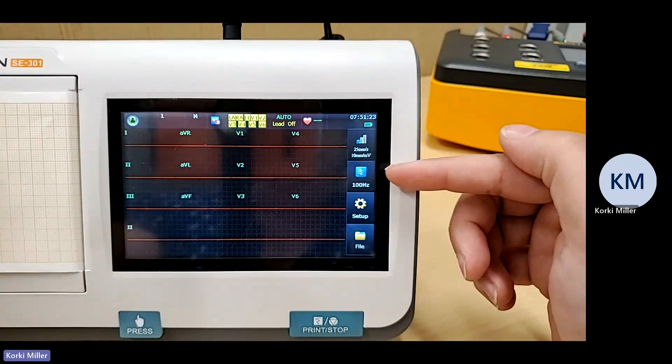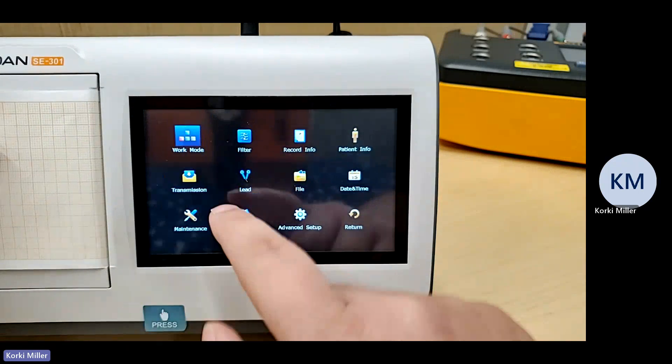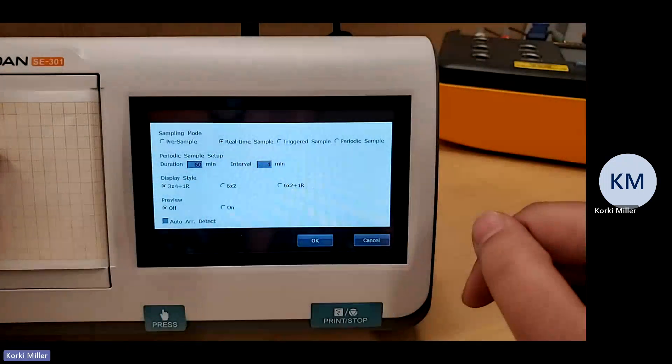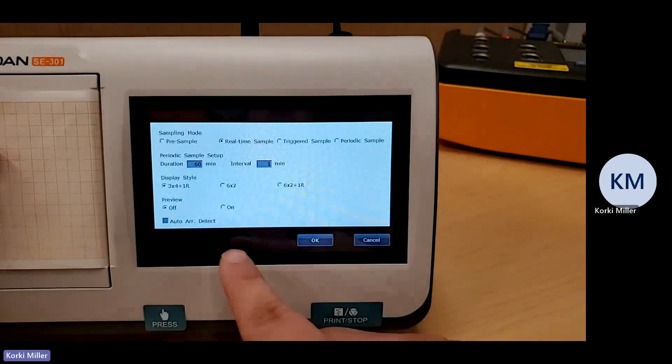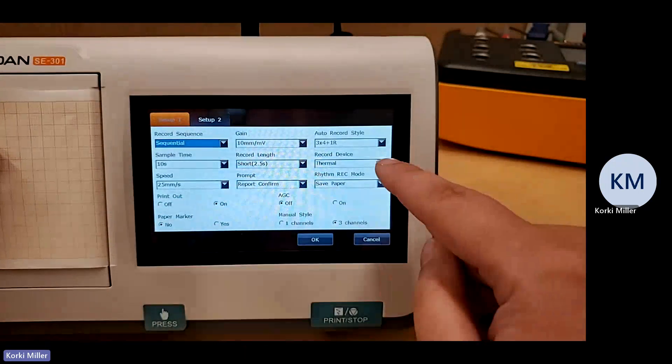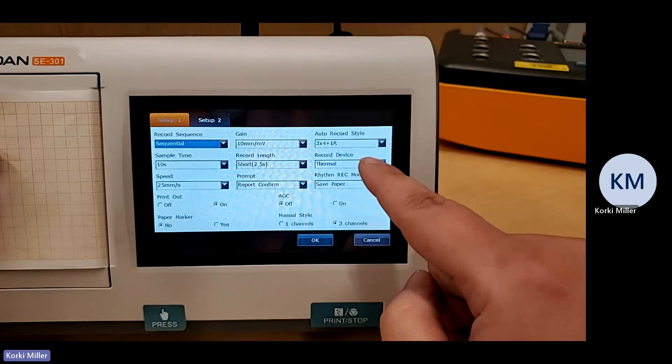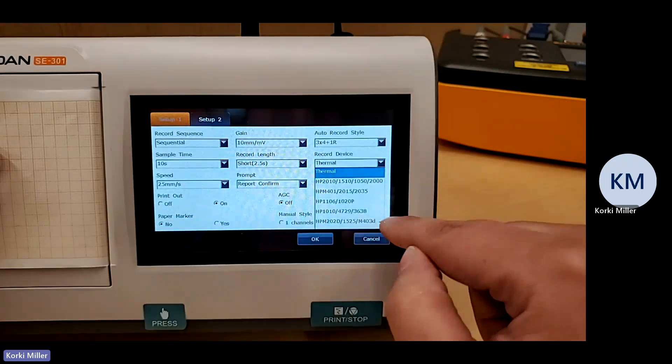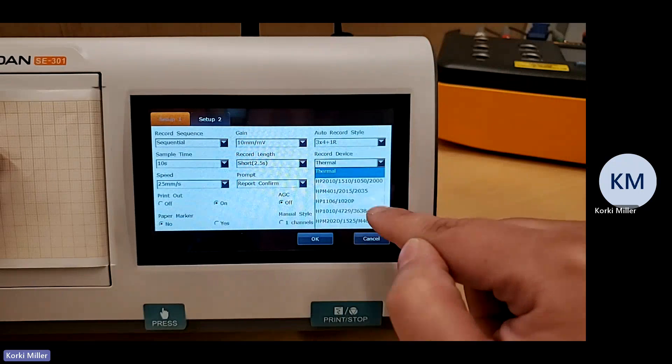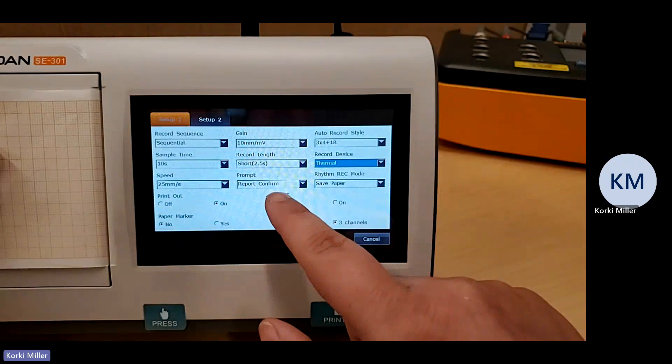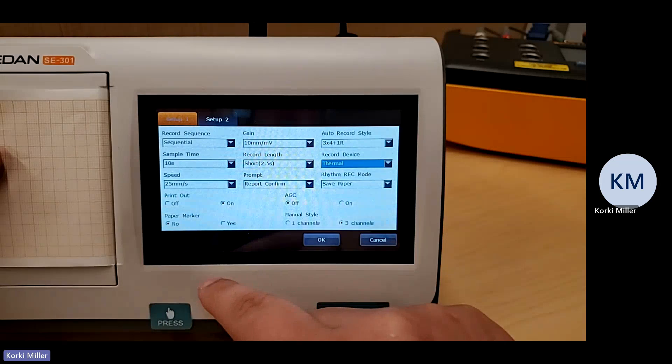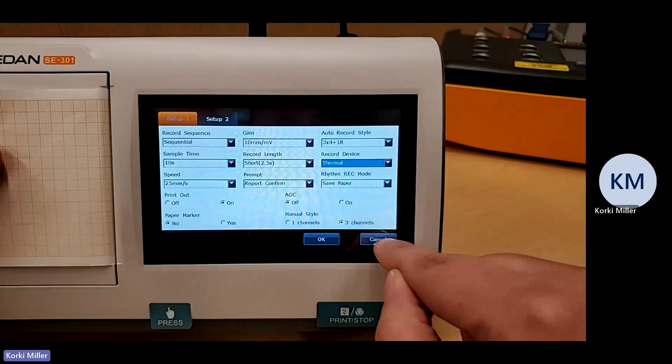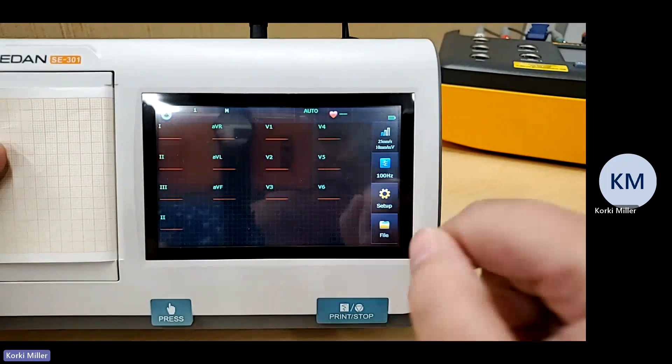You have filters here. You have printing speeds. You can also go into setup and go through some other things like your work mode. And it'll let you know what kind of display style you're using. If you have your preview on and off. You can go into record info, how you want it pre-ordered. Their display on the record can be two different things. Thermal device. You can also connect to the HP printer. But for this purpose, we're using a thermal printer. And it shows our speed and our sample time. Sample time is normally 10 seconds.